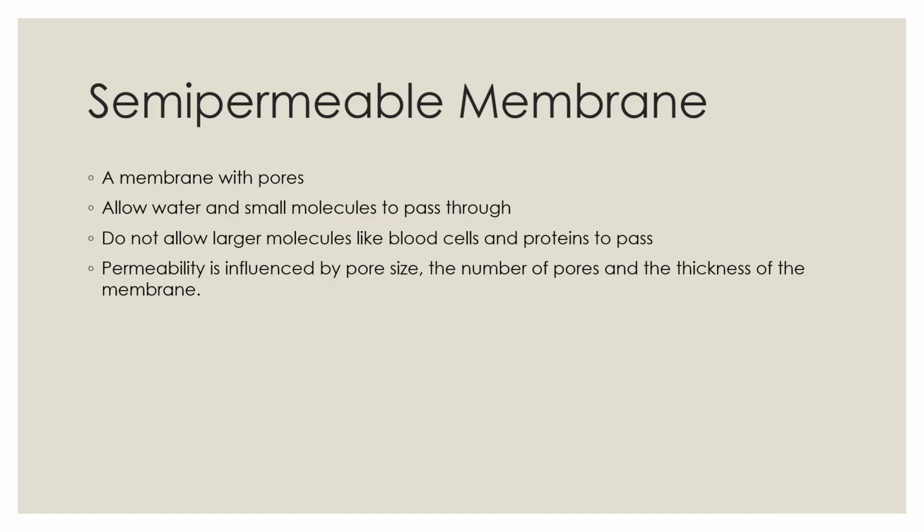Semipermeable membrane: a membrane with pores that allow water and small molecules to pass through but do not allow larger molecules like blood cells and proteins to pass through the membrane. Membranes need to be efficient at clearing waste and biocompatible with human blood, which means exposure of blood to the dialysis membrane produces minimal adverse effects.